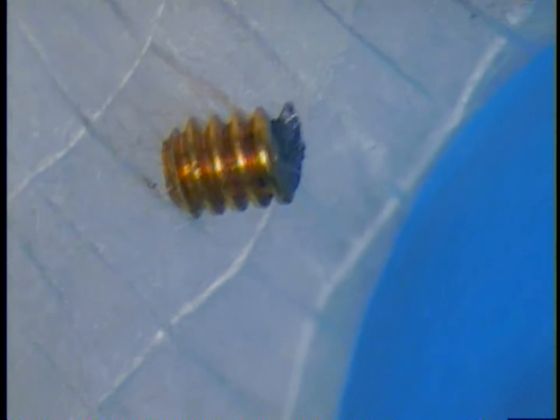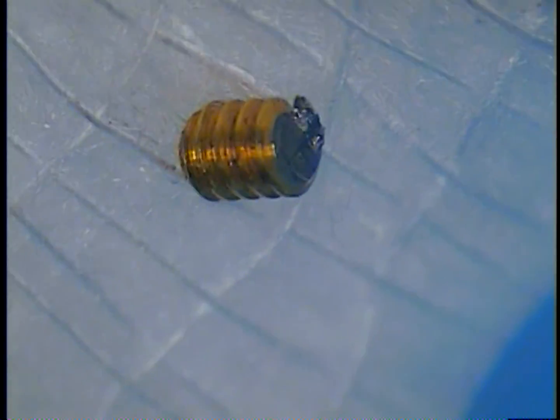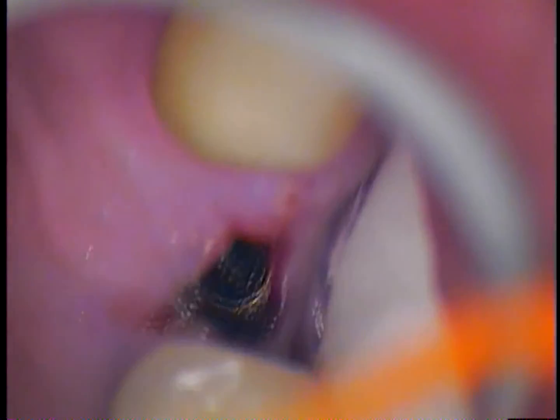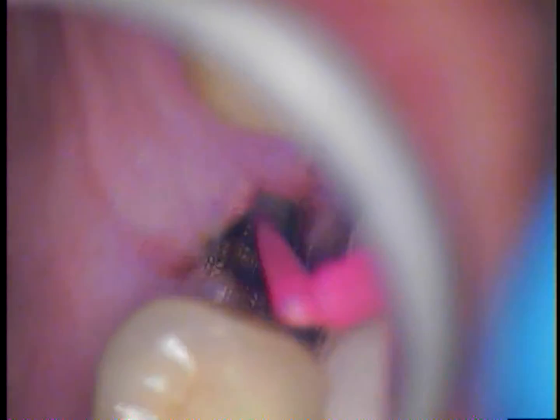Look at the size of that little screw fragment. If you look real closely, there is really nothing else I can see other than maybe some blood in the areas in between the threads — because it hasn't really been trapped that long in there. The dentist that inspected the area first placed cotton in there and did everything right. Keep in mind that these cases are a lot easier when you use a microscope and do not use any form of rotary instruments. Just go in and everything should be scrubbed by hand with soft bristles on the brushes — no metal in that brush whatsoever.